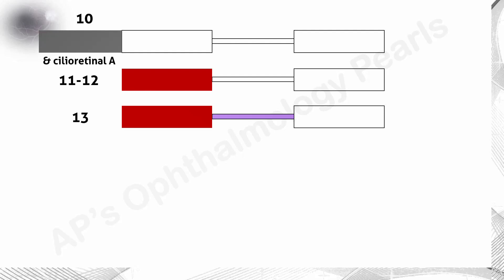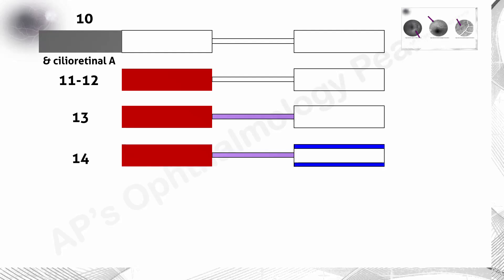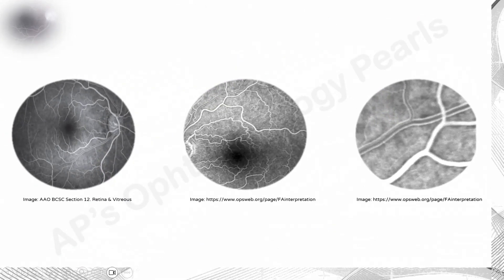The capillary phase occurs soon after at about 13 seconds following dye injection. Next is the arteriovenous phase, wherein the dye flows into the precapillary arterioles, capillaries, and postcapillary venules. This begins about 1 to 2 seconds after the arterial phase, and in addition to seeing the filled arterioles, laminar flow is seen in the venules. The faster-moving blood in the center of the veins appears dark because it arrives from more distal veins, which initially have a lower fluorescent concentration.